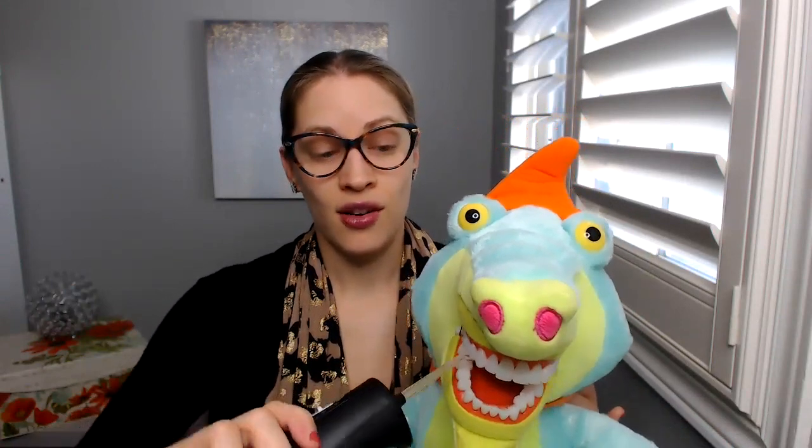Does that make sense to everybody? With this portable one, I can do the top teeth and the bottom teeth without having to change the water. When I first started using it, it took me some time to get used to it, so I probably had to switch out the water a couple of times — but that's okay. It's so much easier to have a portable one. Do all of the outside teeth, top and bottom. With practice, you can do the inside too, which helps to get things as clean as possible.